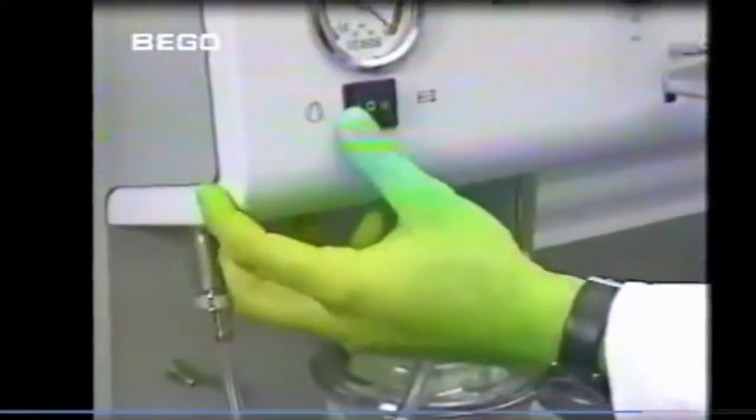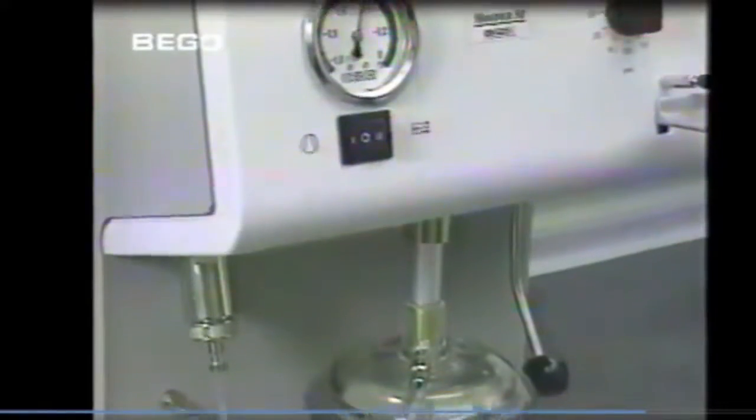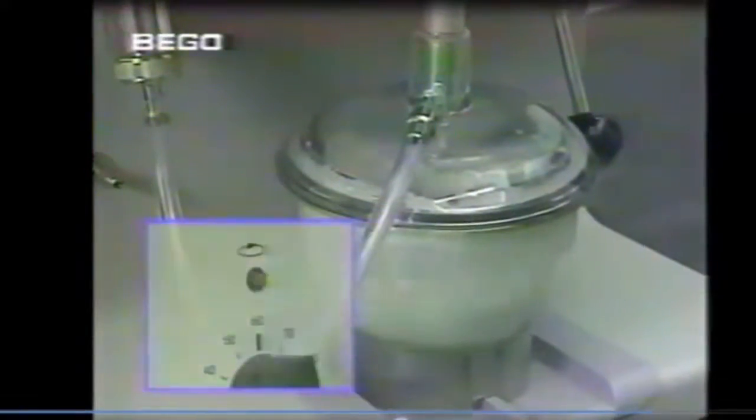To avoid bubbles, the investment material is mixed for 60 seconds with a powerful mixer. The hose is not removed until the vacuum has been released.